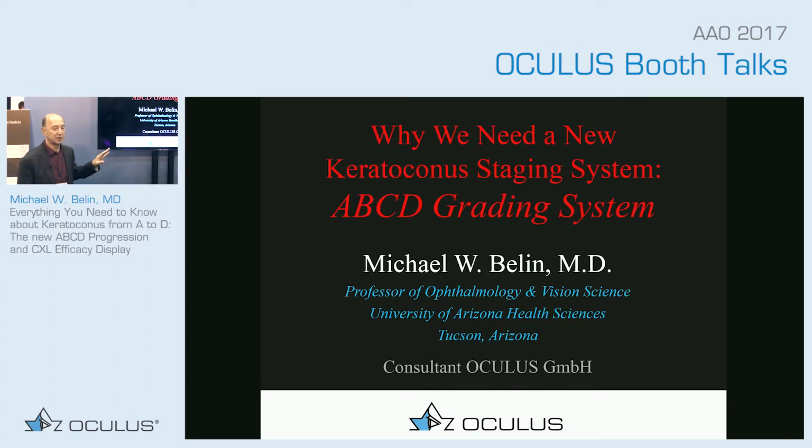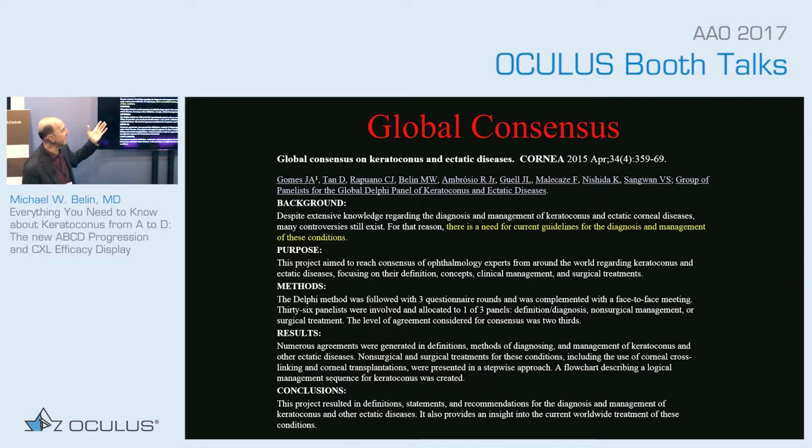So that was just an introduction, and you'll understand now why I started with that, because it's important to understand the concept of that exclusion zone that we use in the BAD display. This is now about 1.5 years old, or closer to 2 years now, but there was an article in the journal Cornea, actually from the 4 major cornea societies: the Cornea Society, Asia Cornea Society, Eucornea, and Pan Cornea. So that's South America, Asia, Europe, North and South America got together, and we did this consensus document on keratoconus.